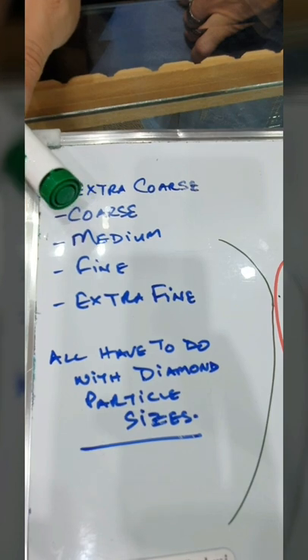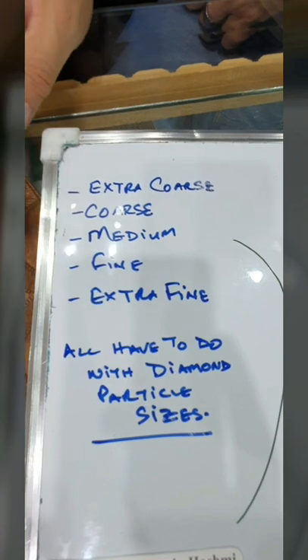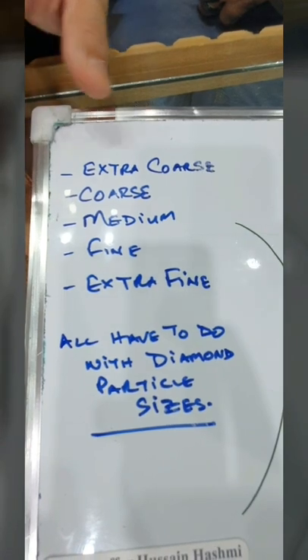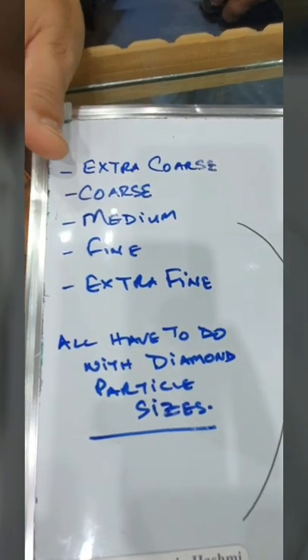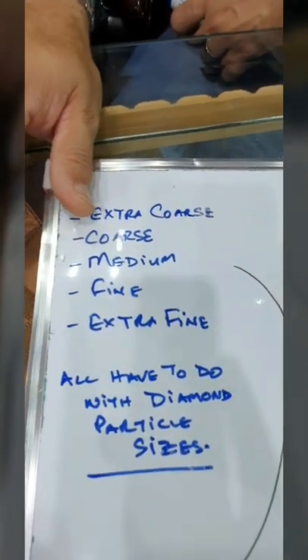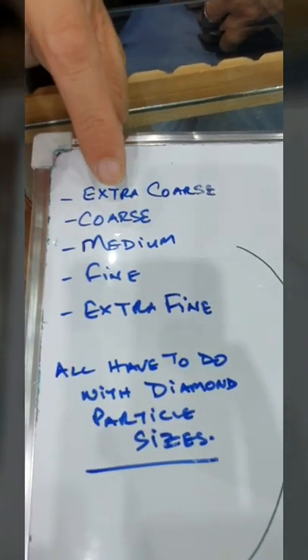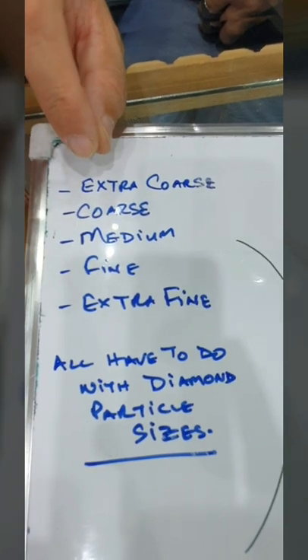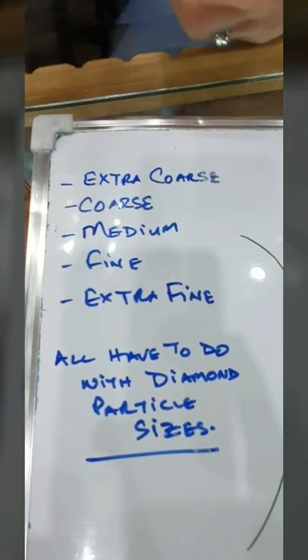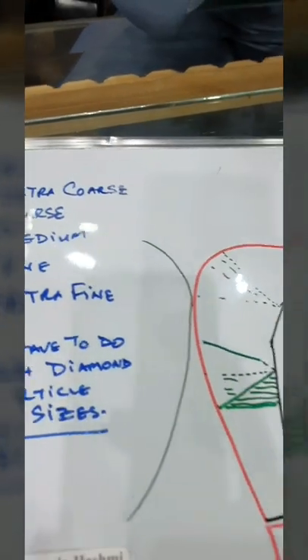So you must clean that off, and you can use piezo to clean it off. If you have left the tooth unprotected in the mouth with no temporary crown, definitely know that not only plaque would form, but also tartar would start forming. From periodontics books, we do remember that it only takes 24 hours for plaque to start mineralizing into hard tartar over a 24-hour period of time. So the coarseness would be a counter effect to you, and you would need to clean the tooth surface very thoroughly before cementation.